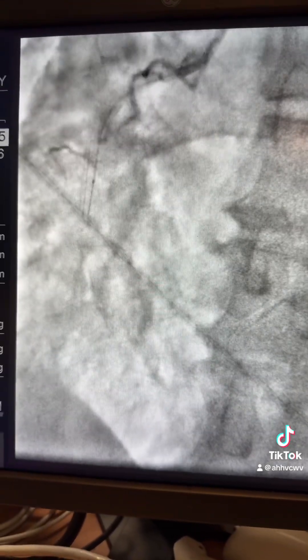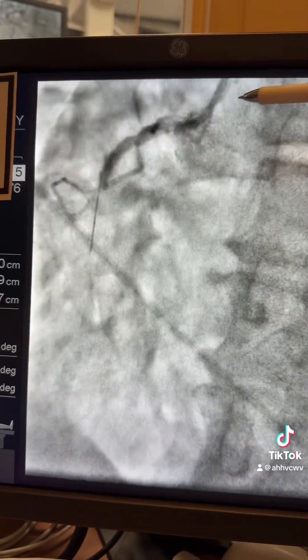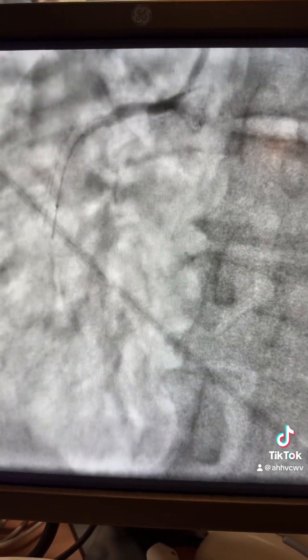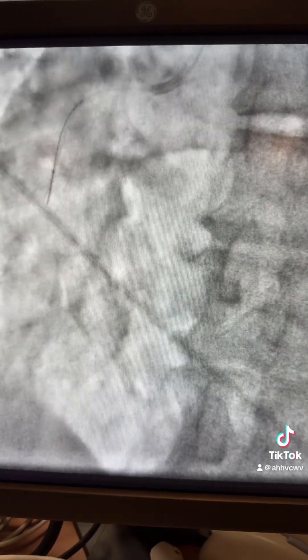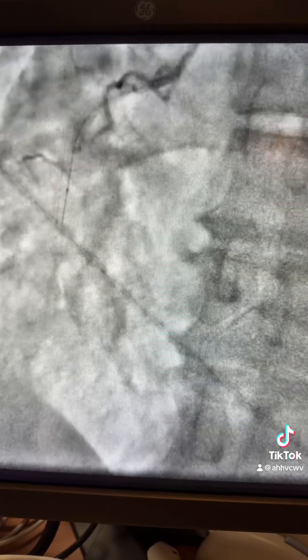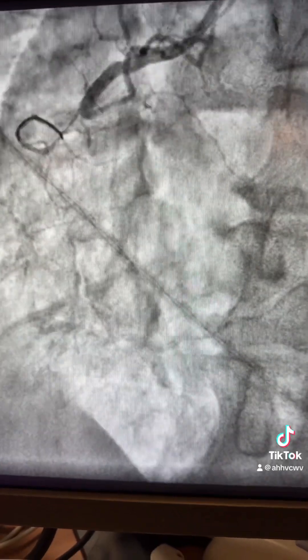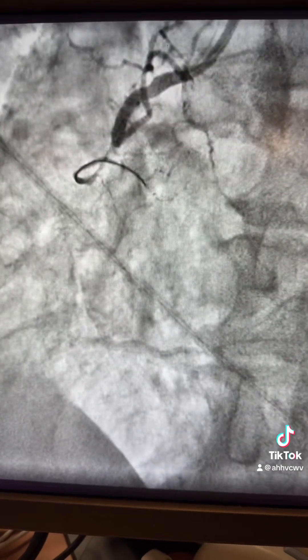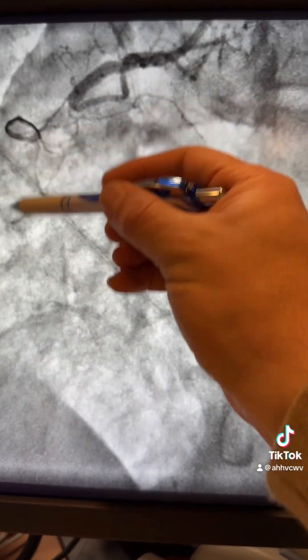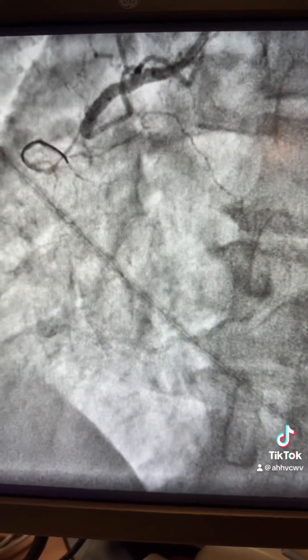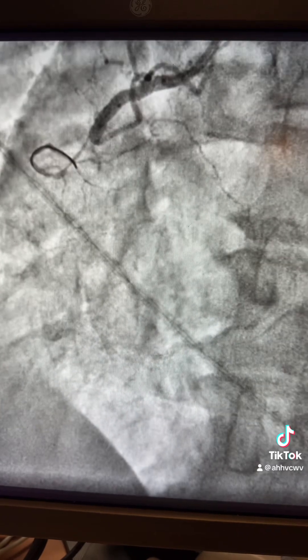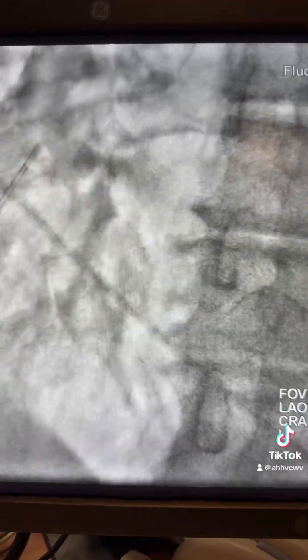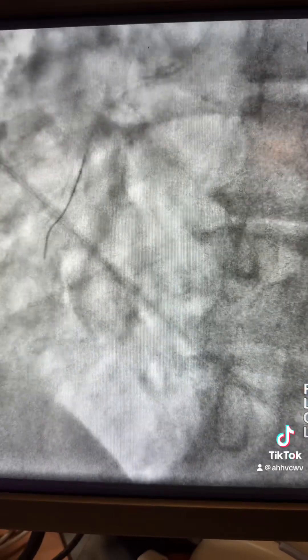Starting the case with a PT wire, using a JR4 guide with the PT wire supported by a small 1.5 balloon. The wire initially kept going to the side branch, which is okay. We balloon this area for better visualization distally, and then redirect the wire toward the distal vessel, advancing the balloon support.